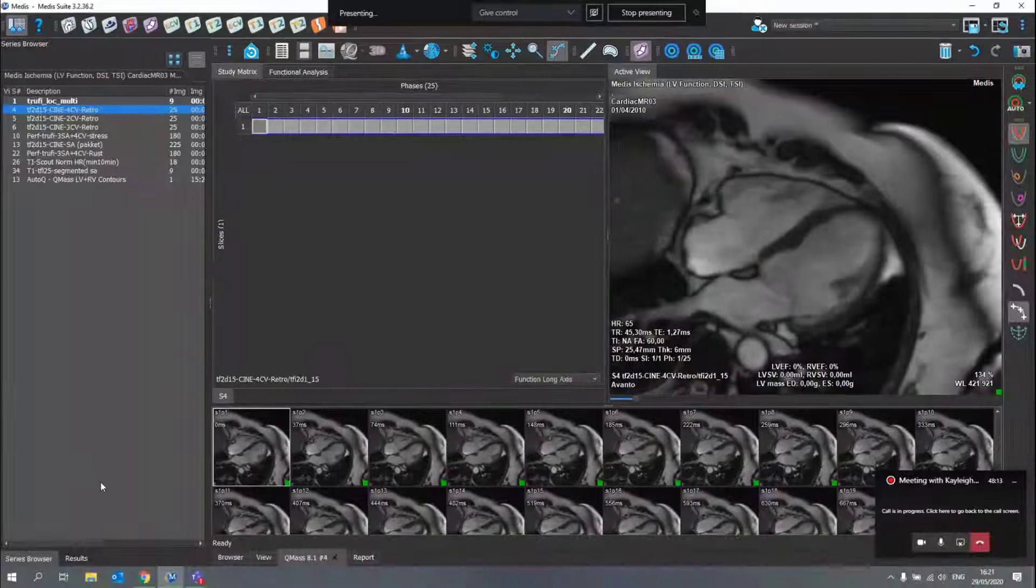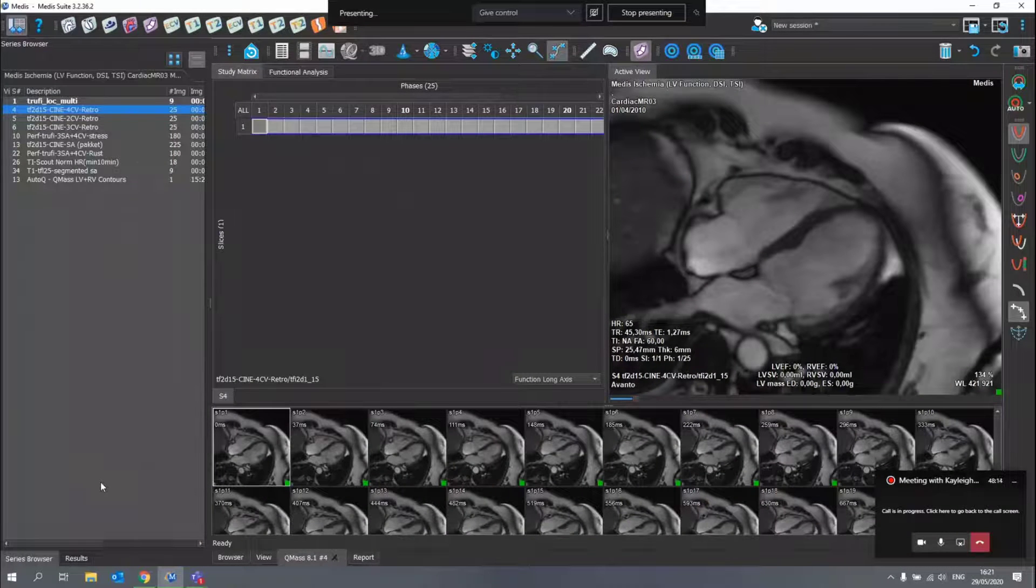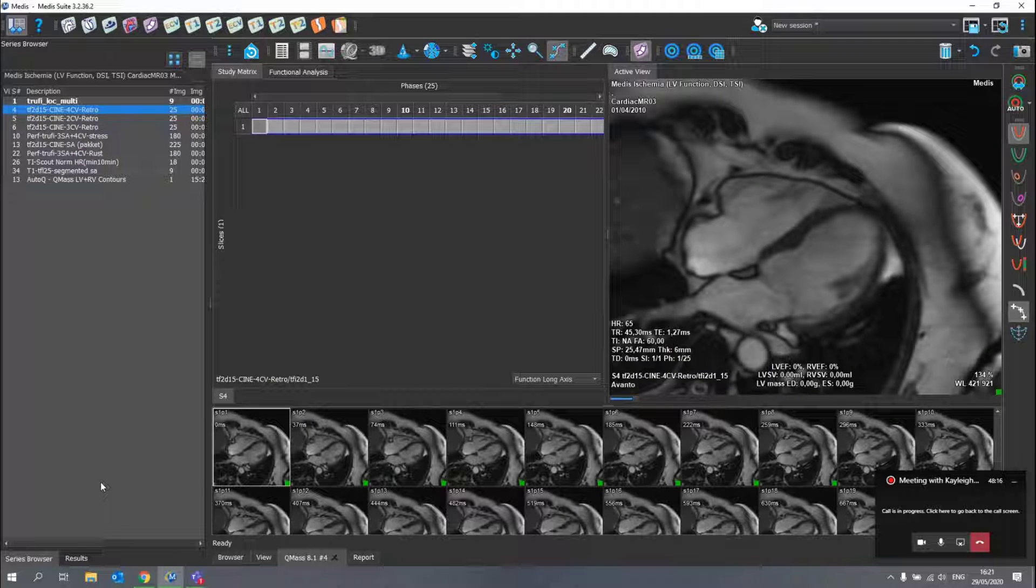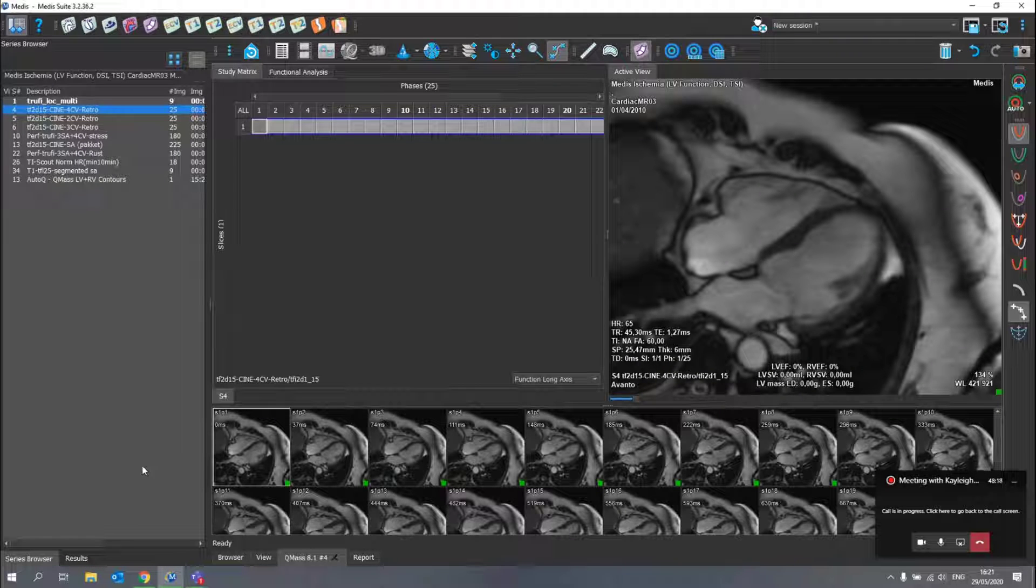For that, I will first go to the QMAS application. As you can see, I loaded a four-chamber view here in the QMAS application.